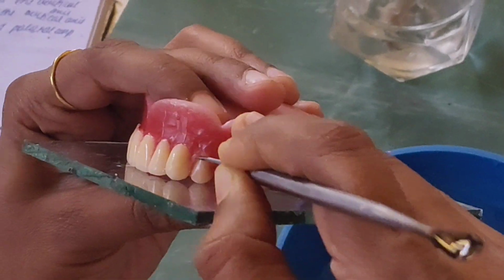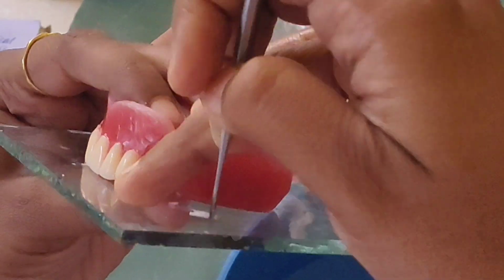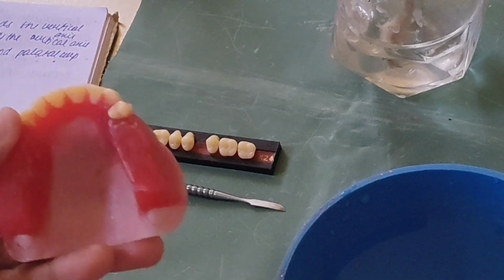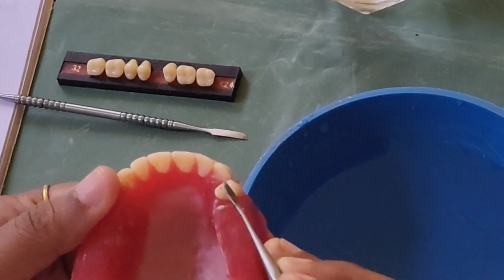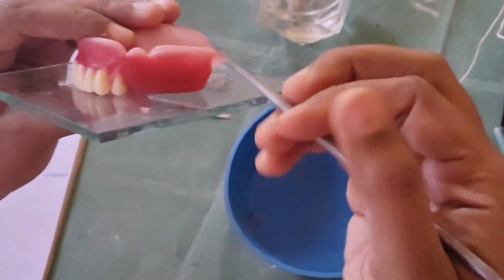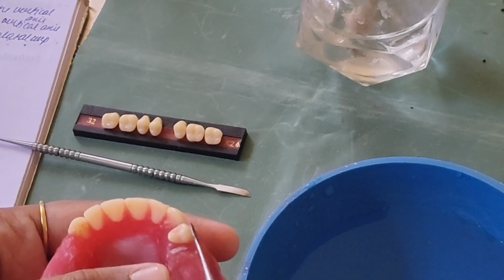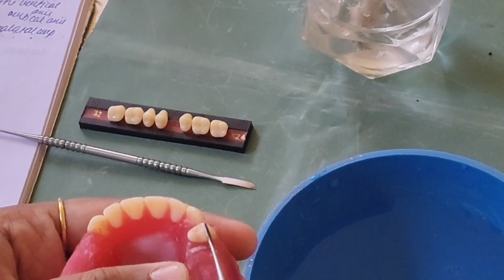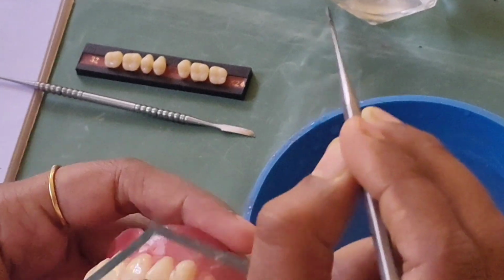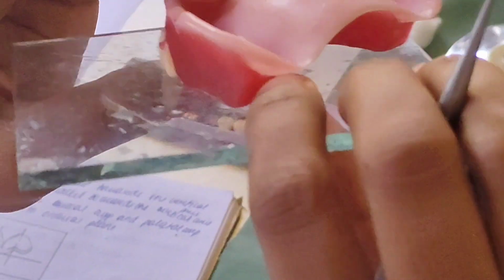From the buccal side, when we see, this is straight. From here, this shouldn't be going down, this equally should be on the same level. Okay. When we check the glass plate, we have two cusps, this and this. So this side is buccal, this side is palatal. This buccal cusp will touch, this palatal cusp won't touch for the first premolar. So this buccal cusp is touching. This palatal cusp is not touching.